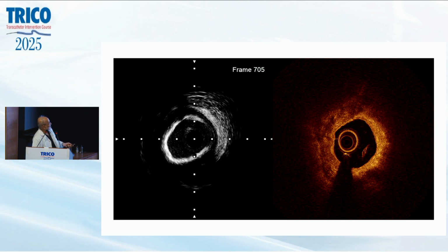Here also you see, but you can't judge the calcium thickness very precisely. You can judge with OCT. And here again OCT gives you an idea which we feel is very important. It is heterogeneous. This is a heterogeneous sort of calcium. Despite it being very thick, it has very high chances of getting broken by a high pressure balloon.